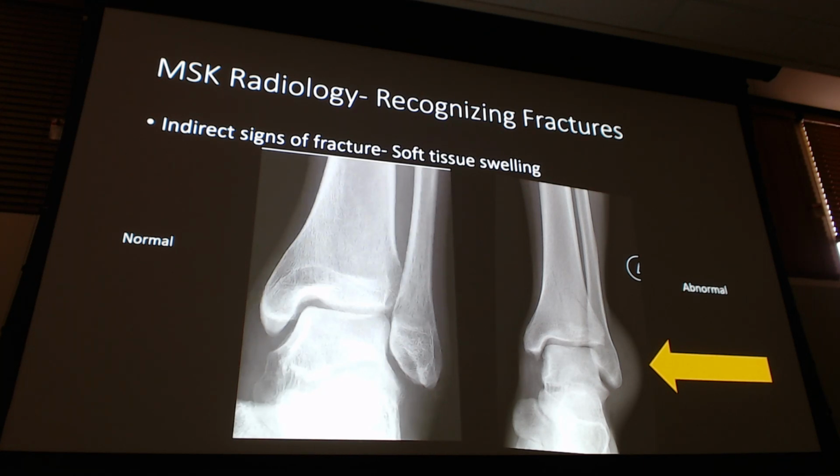Then what's next for me? I go into my medullary canal. I'm going to go into the fibula first. Not too bad. Oh, what's that? What's that? We saw this in the tibia. Good. And you're going through your stepwise process. Look at how subtle that is. Look at how easily that is able to be missed, right?